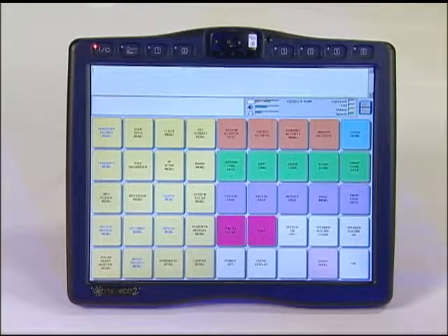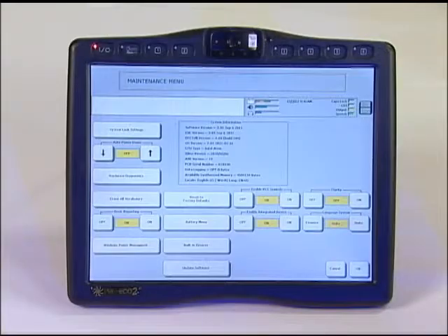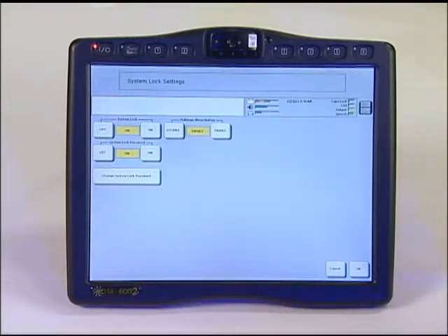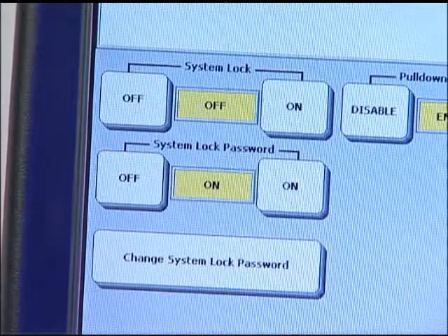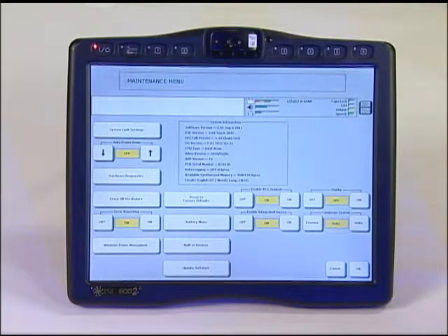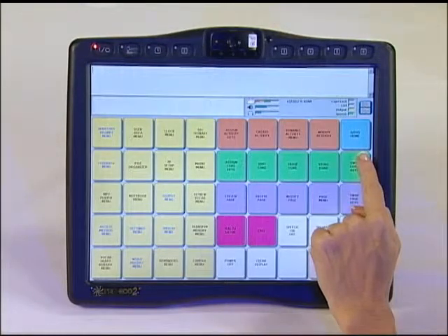Once you see the toolbox menu, select the maintenance menu, and then system lock settings. Turn the system lock to OFF by selecting the OFF key. The toolbox is now unlocked and you are free to make changes. Select OK and then OK again. Exit the toolbox using the light blue go to home key at the top right of the screen.